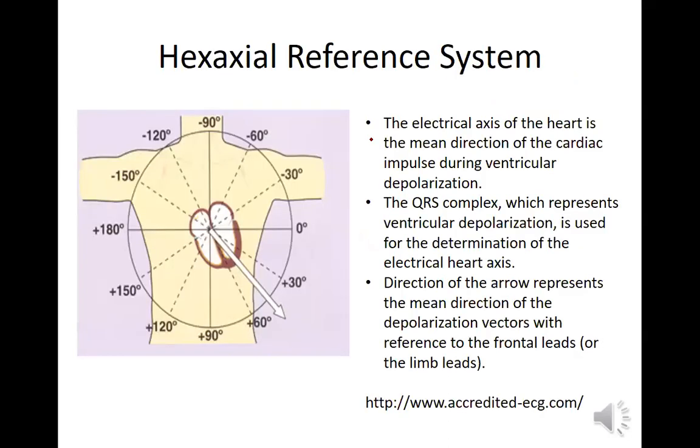So here it is, what I'm talking about. And you can memorize the angles, which really is helpful. These numbers are negative. It's just filling out 360 degrees split in half. So again, AV node, ventricles, draw it. Left ventricular wall, mean QRS vector. And then put where the leads are. Like this would happen to be lead 2. And this is the positive electrode. Where's the negative? Up here. AVR, positive. And so forth. Just go through all of that. Lead 1, positive. Put an arrowhead. Put a positive. Put a negative.